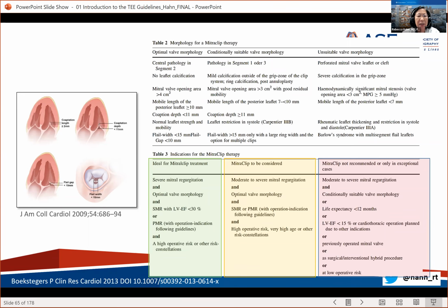So just be a little bit careful there if you're asked to come up, because there's now only moderate mitral regurgitation under general anesthesia, because in all likelihood it's severe when they wake up, or it may be moderate when they're asleep and it's severe when they get up and run around.